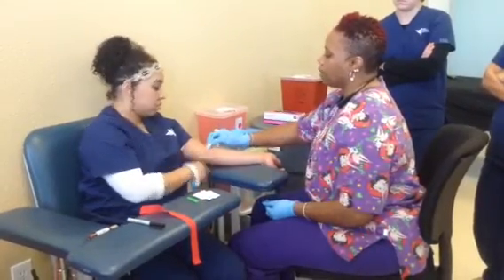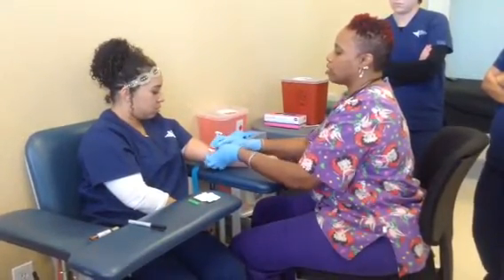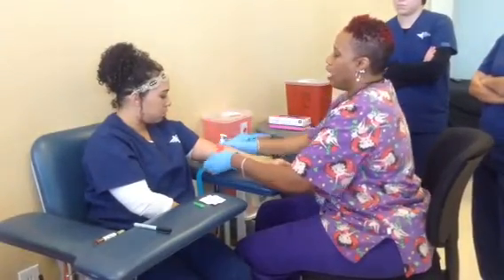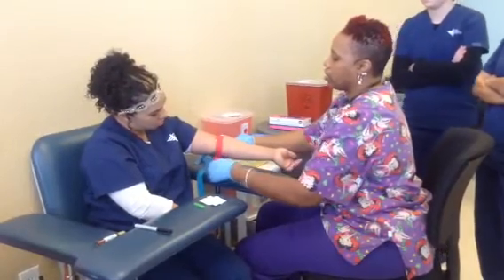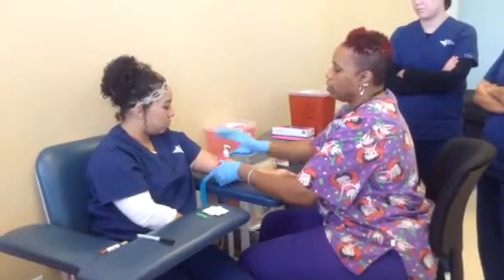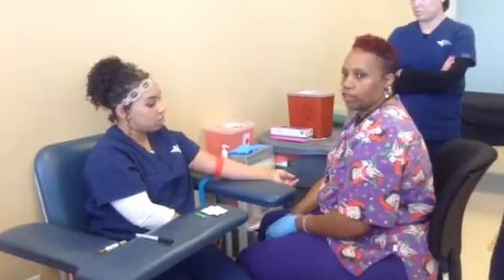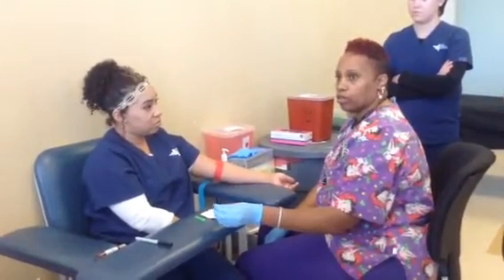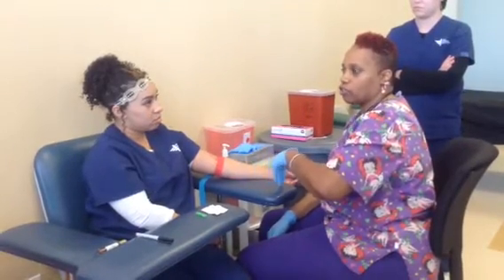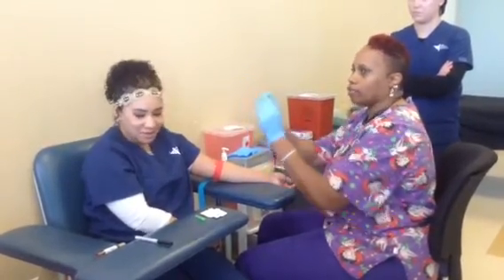I'm going to look at my patient's site and make sure it's not bleeding excessively. If your gauze has excessive blood on it, make another pressure gauze bandage and change them out before you wrap your coband. Coban sticks to itself so it doesn't have to be wrapped extremely tight where it's cutting off circulation. I let my patient know they need to keep that on for approximately 5 to 10 minutes, then I thank my patient for coming into the lab. If you have six tubes, that patient has to verify all six tubes one by one — you can't hold all six up at one time.